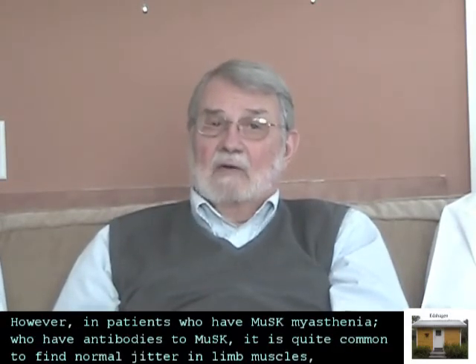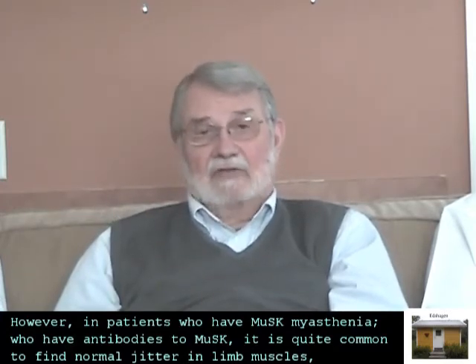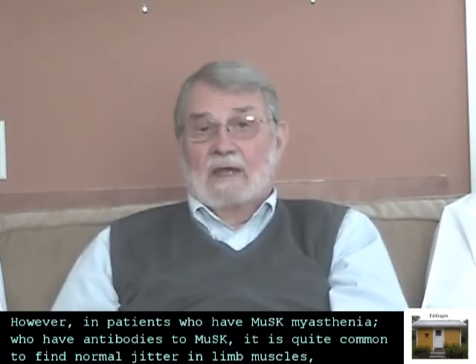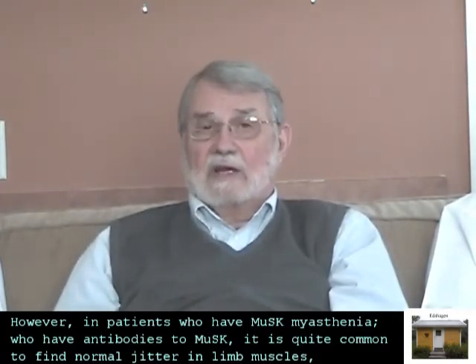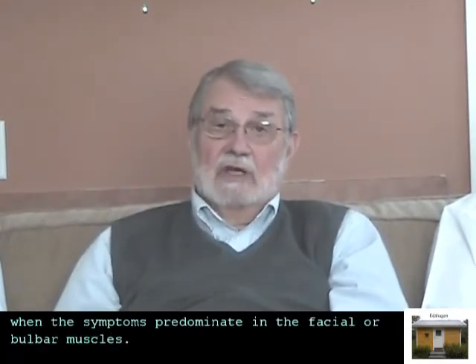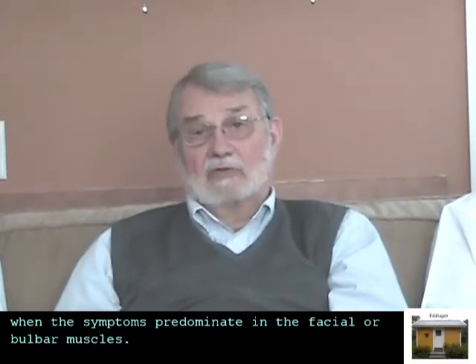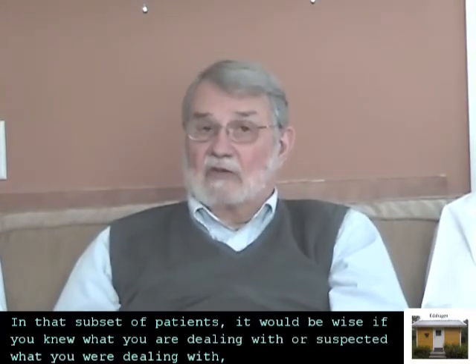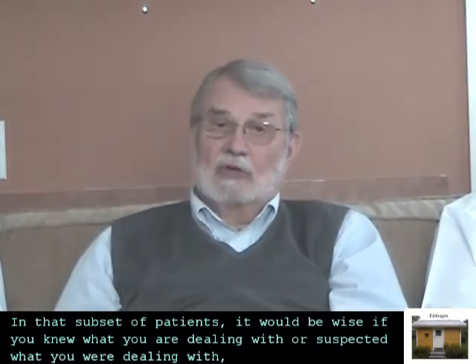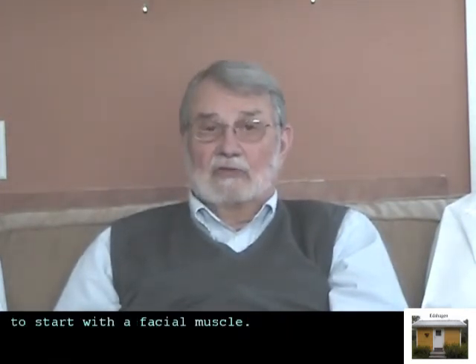However, in patients who have MuSK myasthenia, who have antibodies to MuSK, it is quite common to find normal jitter in limb muscles when the symptoms predominate in the facial or bulbar muscles. So in that subset of patients, it would be wise, if you knew what you were dealing with or suspected what you were dealing with, to start with a facial muscle.